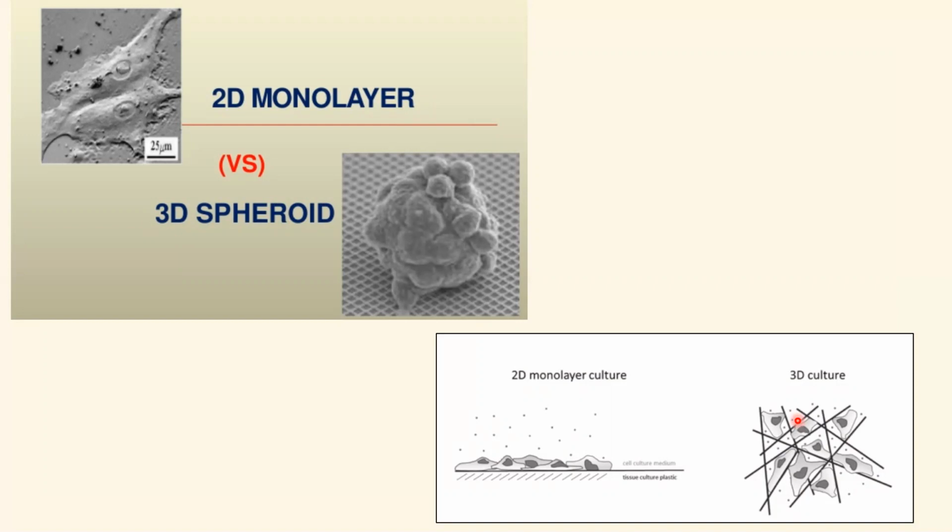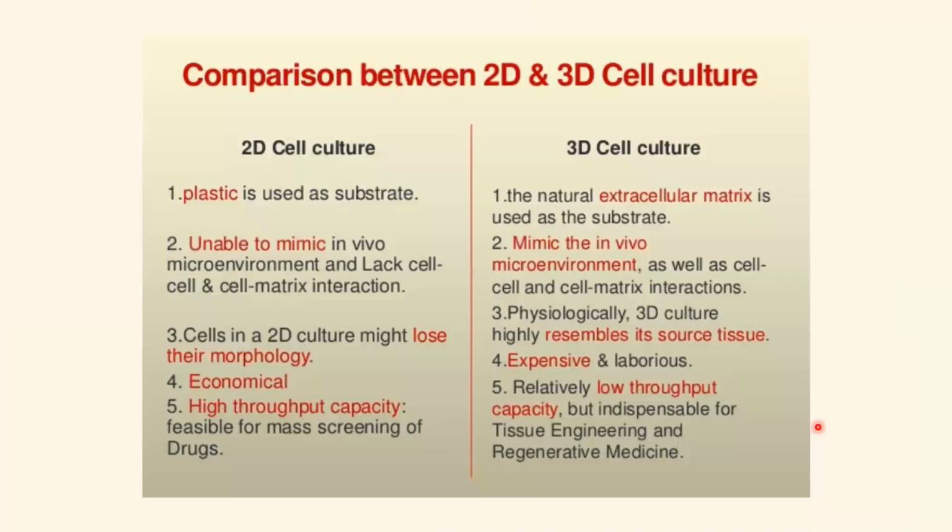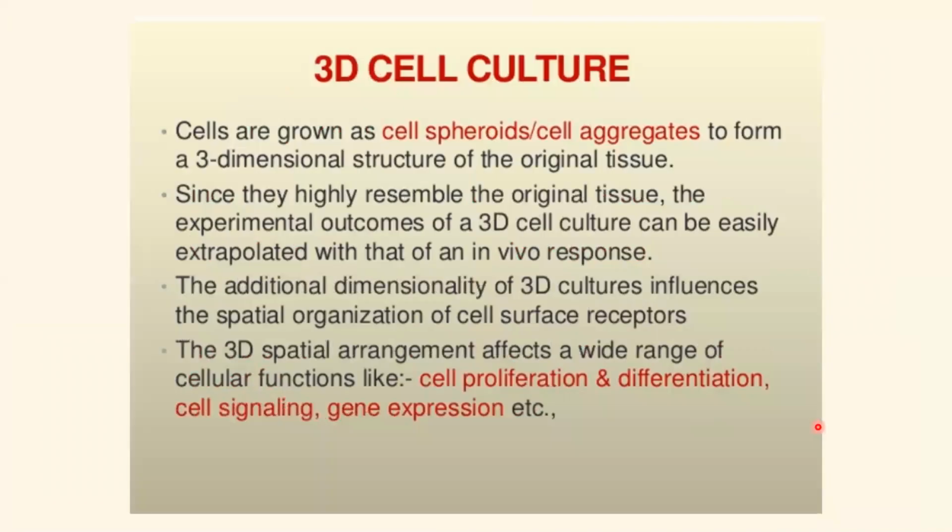This is more likely to mimic the in vivo conditions. So they highly resemble an original tissue, and it can be very easily extrapolated to the in vivo response.